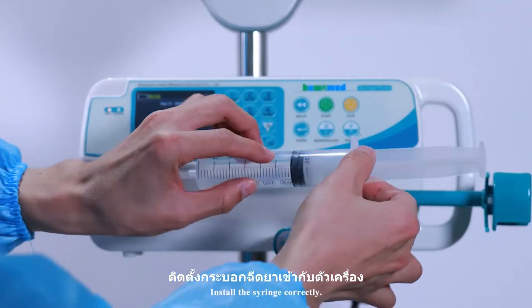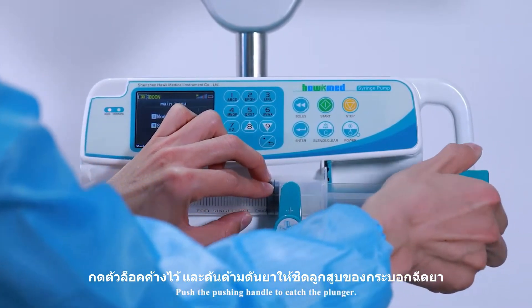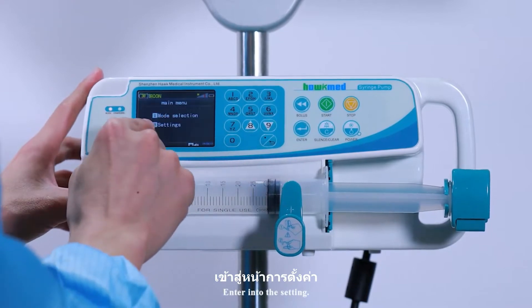Install the syringe correctly. Push the pushing handle to catch the plunger. Then enter into the settings menu.